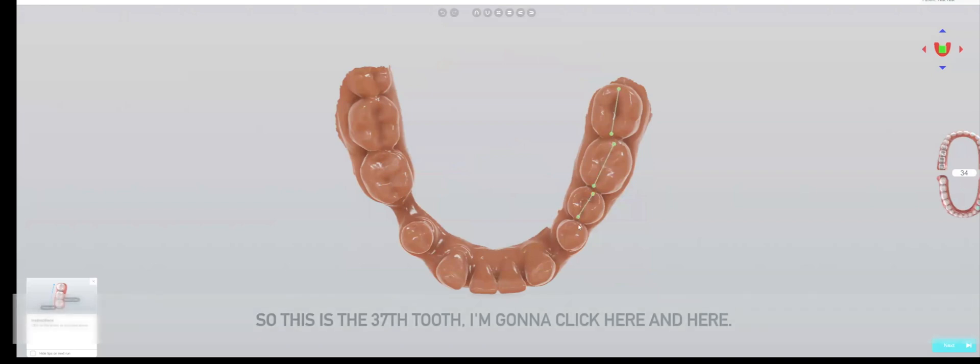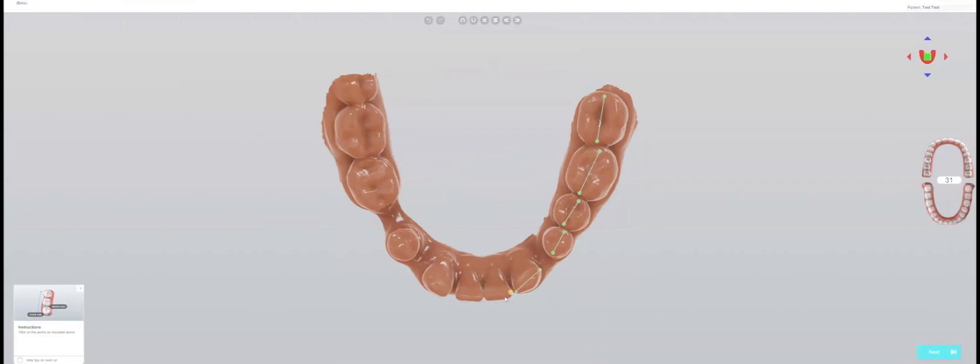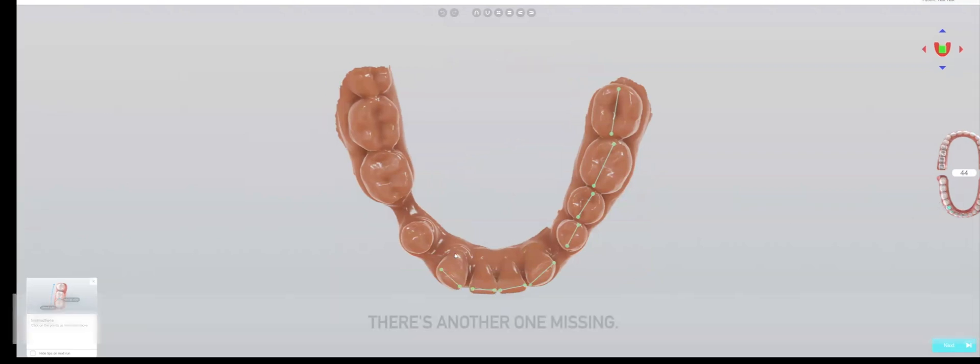This manual step is required to help the software understand where the teeth are located, what their extents are, and also their orientations. I can see that one tooth is missing here, so I'm going to skip over one. There's another one missing, and another one.